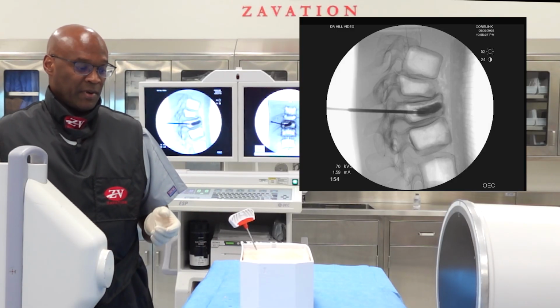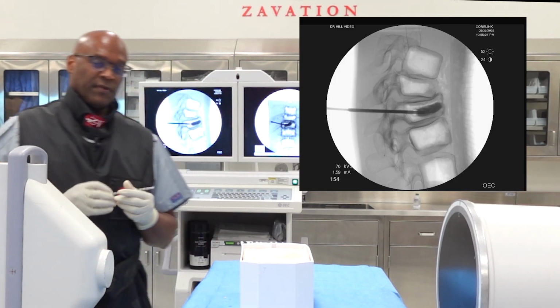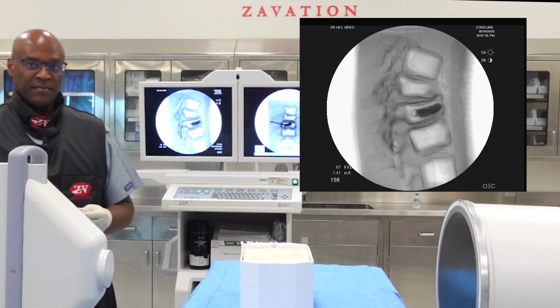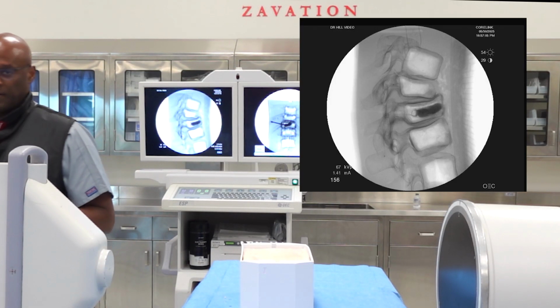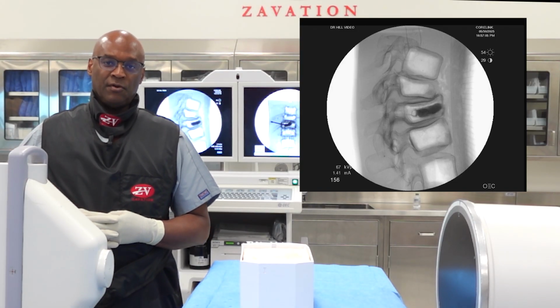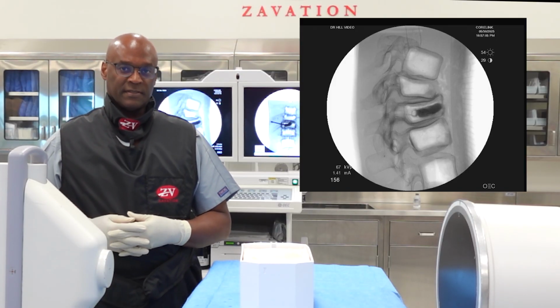So after a couple of minutes, you let it set, and then you can remove the jamshidi. On x-ray, as you can see, there's no tail of cement in the vertebral body pedicle. This concludes the demonstration of doing a unipedicular approach for the ZVplasty system by Zavation.